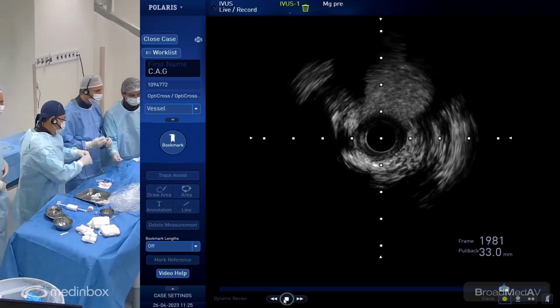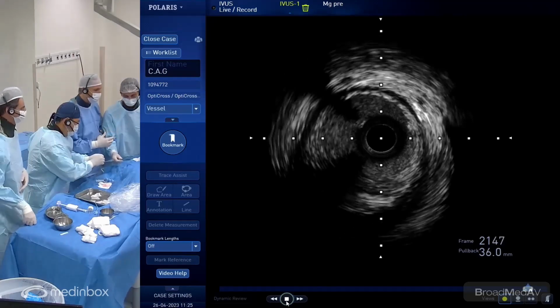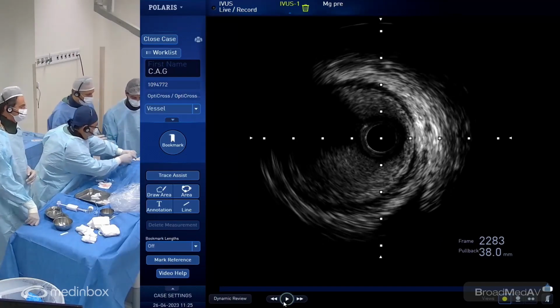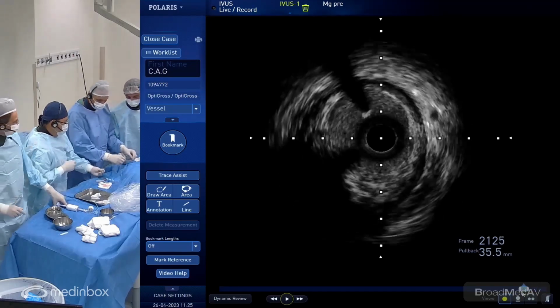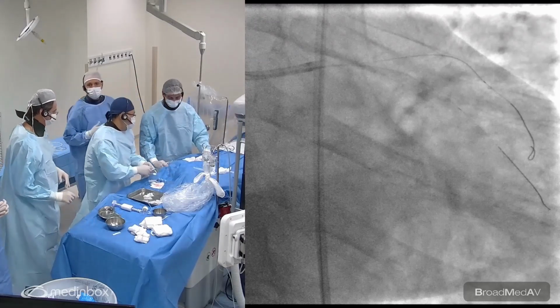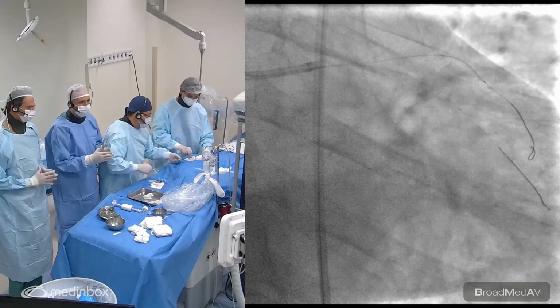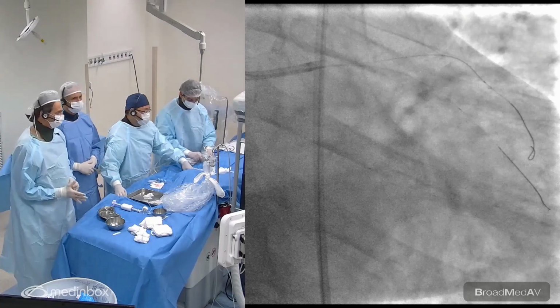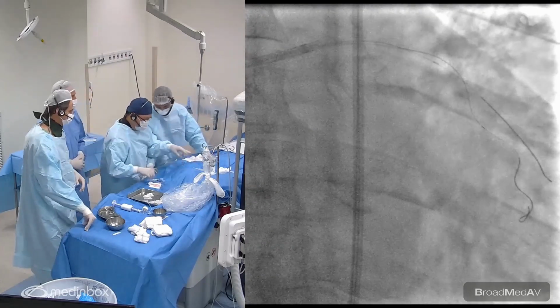Acoustic shadow. And what caught my attention here is at the trifurcation level. You see the disease extending in the left main, and it's a large left main, 4.5. Can you bring the angio again, please? So at this point, what's your conclusion by the IVUS, Ricardo? Yeah, very extensive disease. I think it's about 33, Wagner? 33. The extension of the disease? I think either 28 or 33.